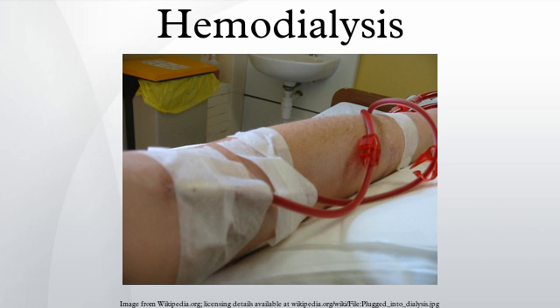Once purified water is mixed with dialysate concentrate, its conductivity increases, since water that contains charged ions conducts electricity. During dialysis, the conductivity of dialysis solution is continuously monitored to ensure that the water and dialysate concentrate are being mixed in the proper proportions. Both excessively concentrated dialysis solution and excessively dilute solution can cause severe clinical problems.